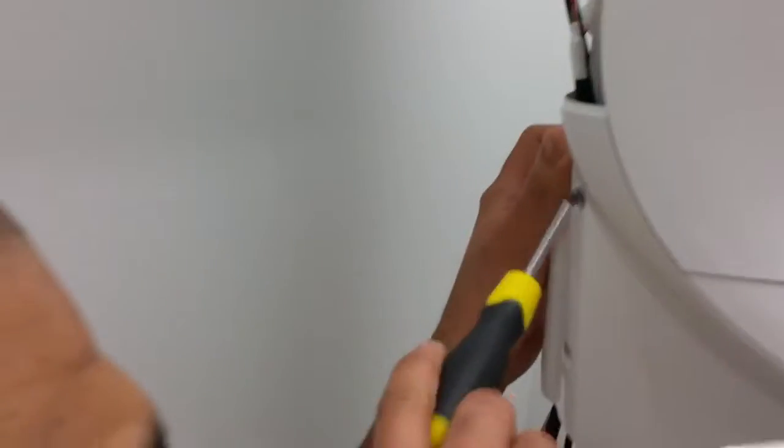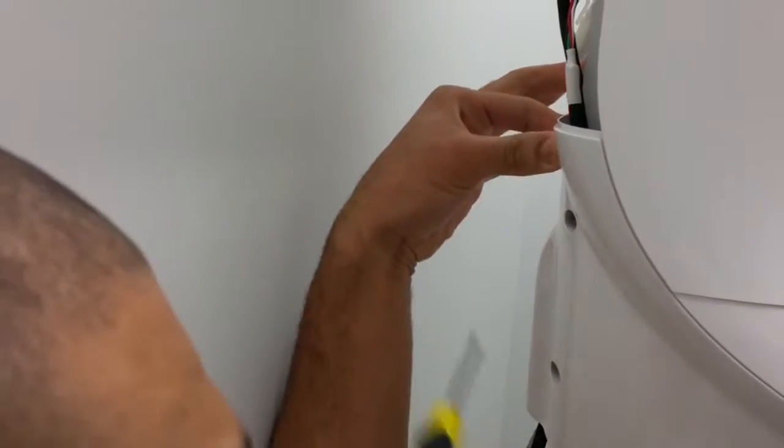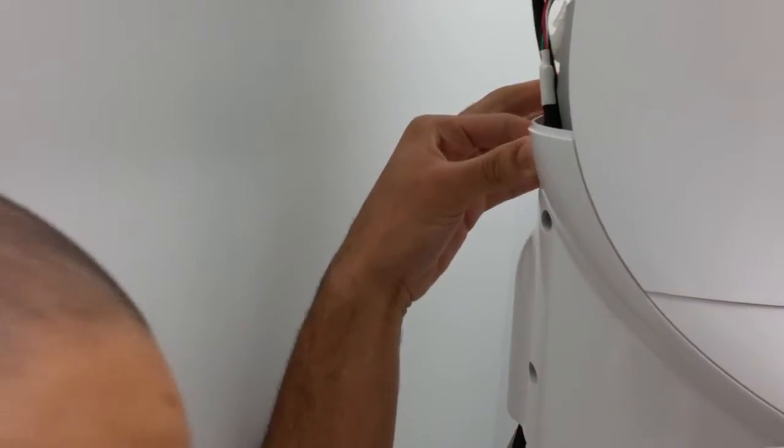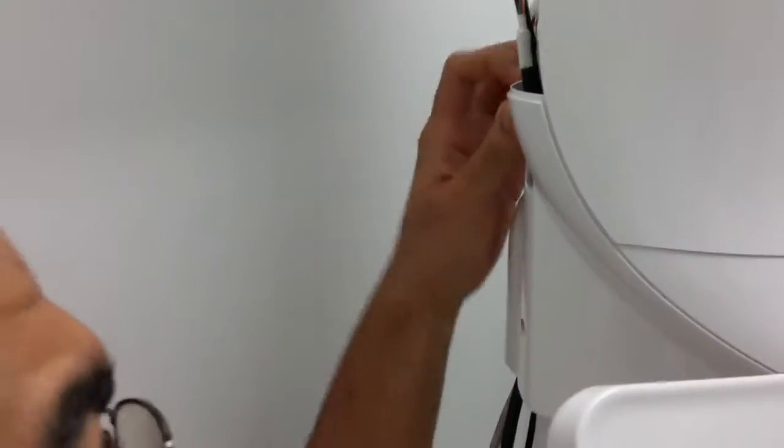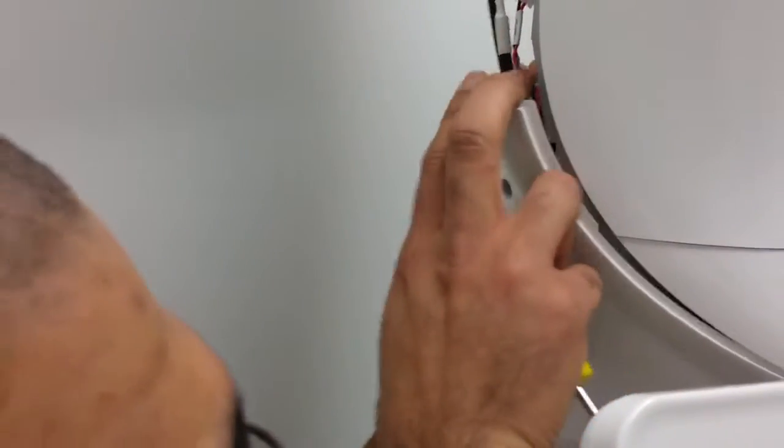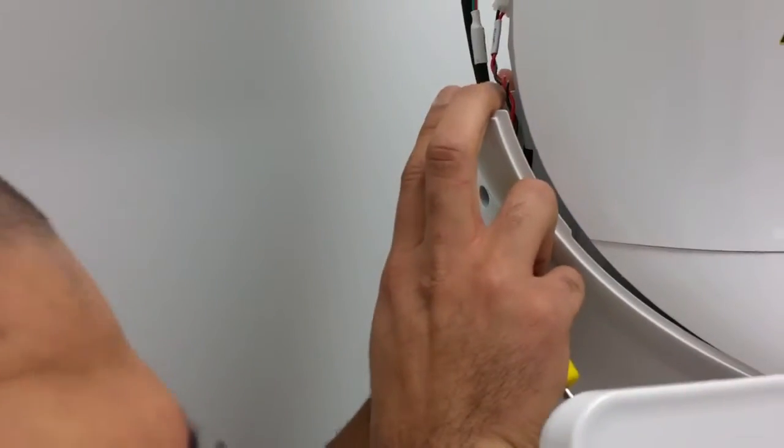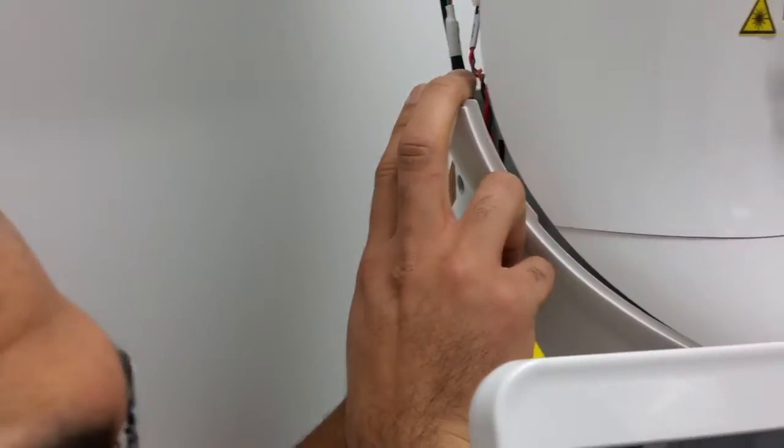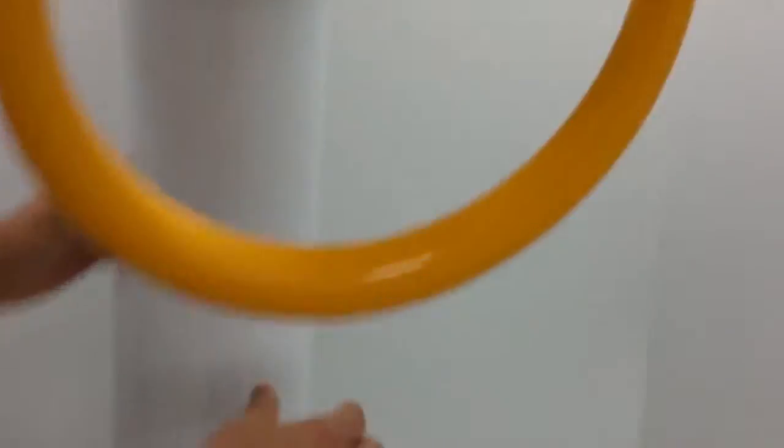We're going to remove two screws here, same two screws on the opposite side. That will give us enough play to pull the back of the casing down, and we're going to move forward to under the chin rest.